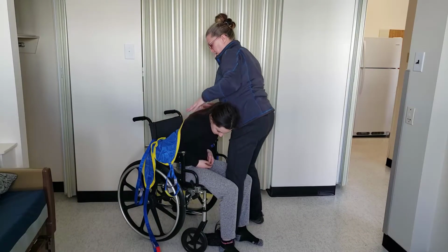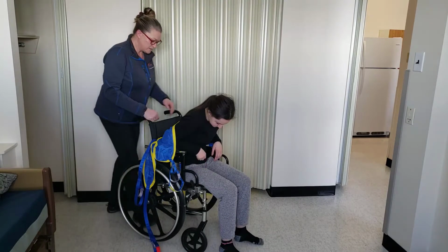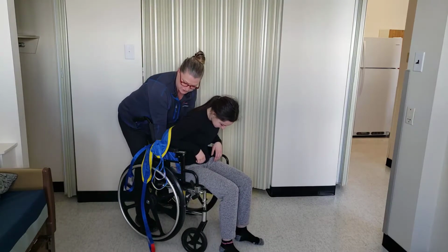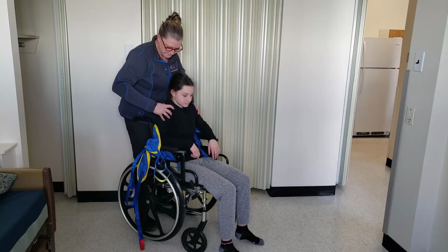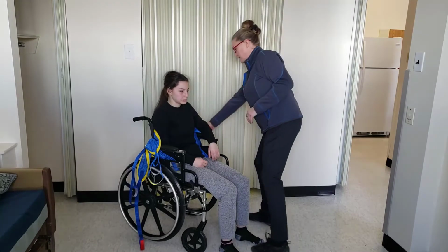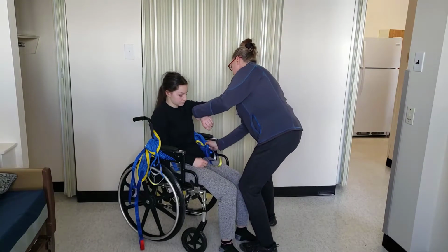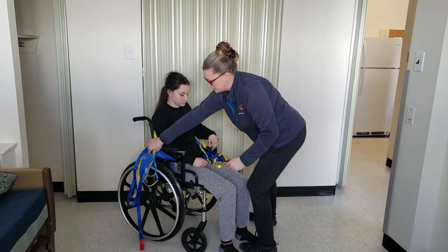If the tenant can stay in this position, you can do this from behind, which is a lot easier to get the material under their buttocks. Once you have it tucked, you can lean them back. You're going to come to the front of them. You want to bring the leg straps down beside them on each side.